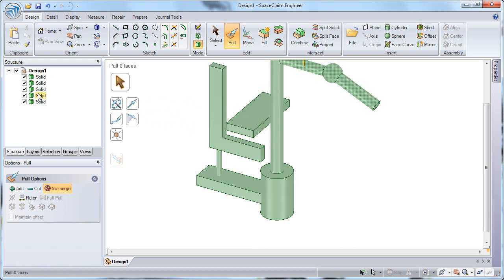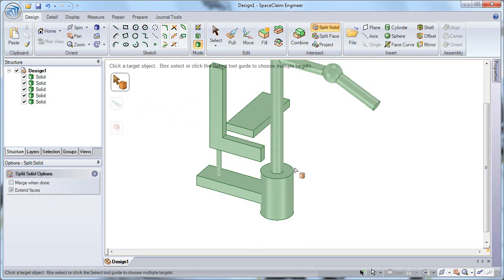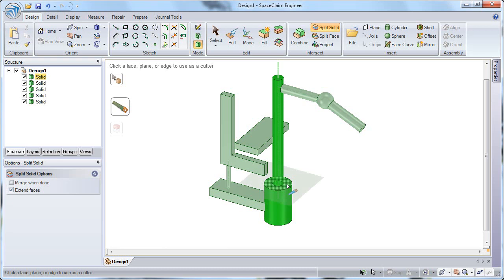So we can do a little bit more work to rearrange these solids into the exact structure that we'd like. Using the Split Solid tool from our Intersect group, we can split that entire tower solid along the top of our base cylinder, and that will split that tower into two separate cylinders.